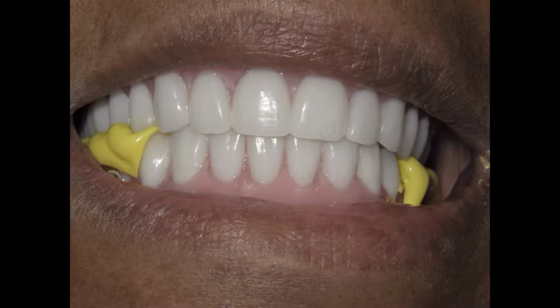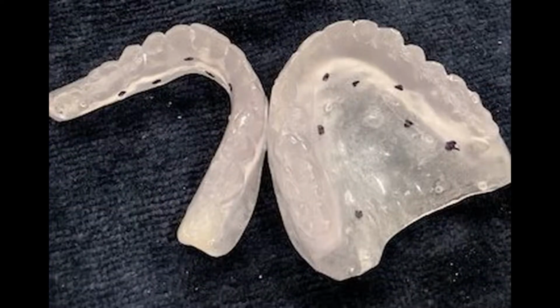In this case, the restoring doctor went through all the steps of creating new dentures that can be used as spares during surgery. This followed conventional denture prosthetic setup and processing. In most cases, the new dentures that are fabricated can be used as a scan appliance by either putting radiographic markers on the surface in 6 different locations, labial and tongue side, or they can be duplicated into scan appliances as imaged here. Please allow the laboratory to duplicate the new dentures to make scan appliances.